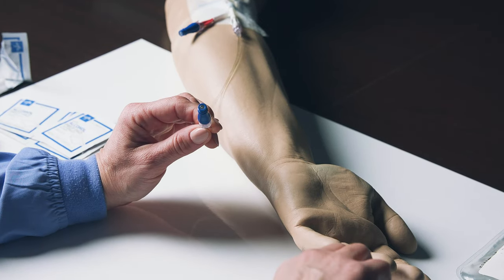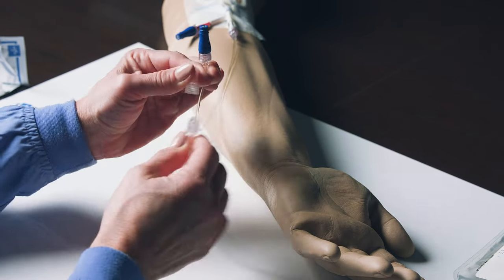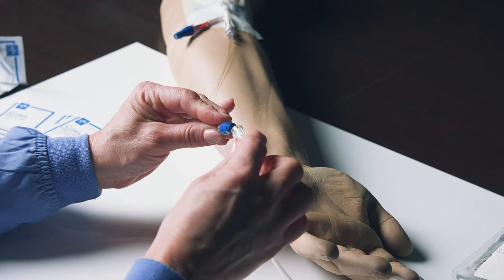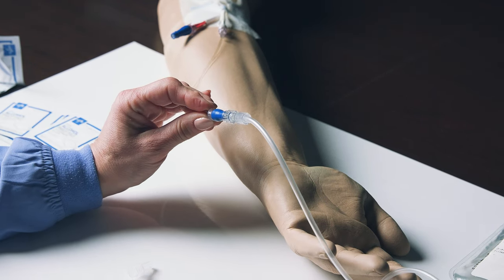Remove the protective cap from the end of the IV tubing. Attach the Sapphire IV tubing to the injection cap on your IV catheter using a push-twist motion. Be careful not to touch the tip of the tubing.